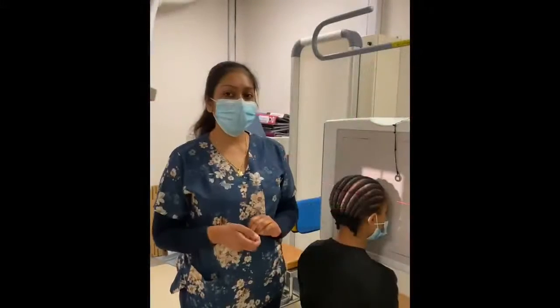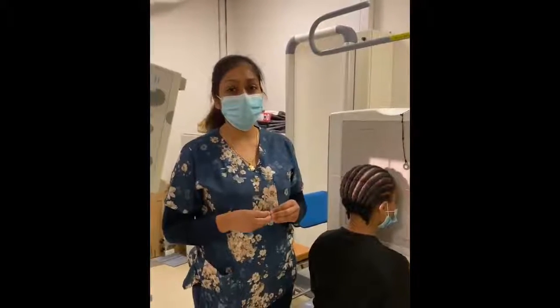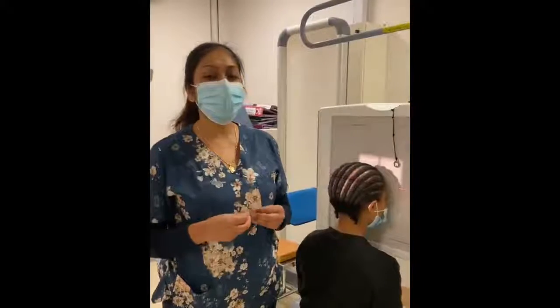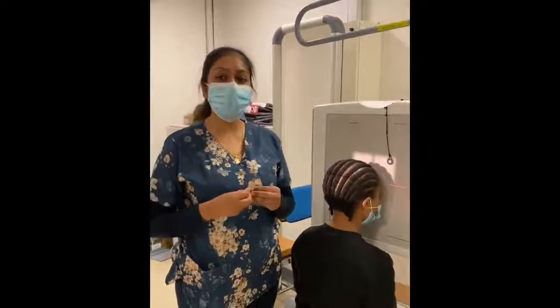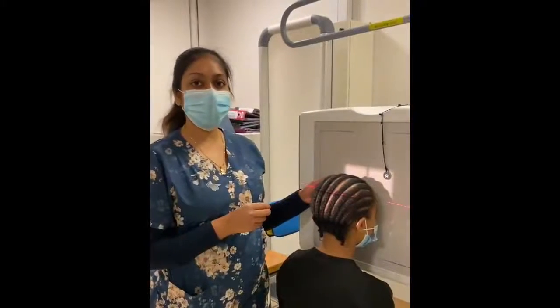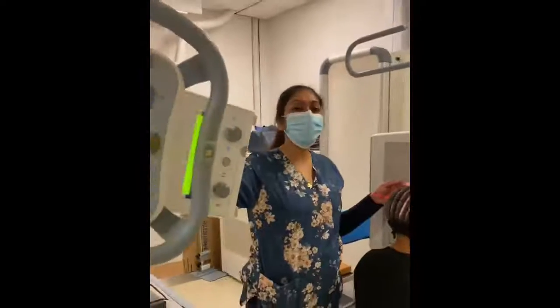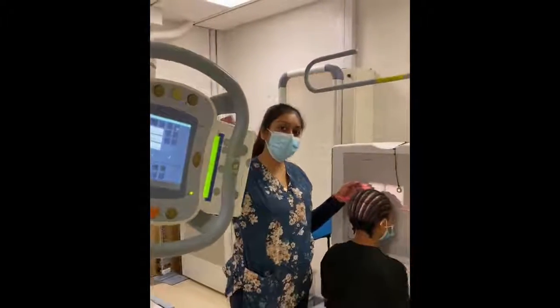Okay, so moving on to your PA axial view, or what you guys know as your OF 15 degrees. The reason that it's an OF 15 degrees is that the beam enters from the occipital area, exits at the frontal area, and the 15 degrees is because our X-ray tube is angled 15 degrees caudally.